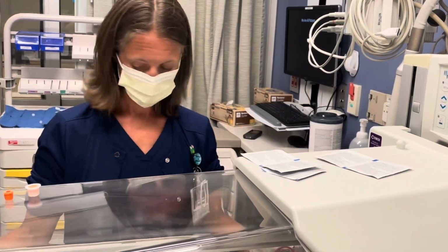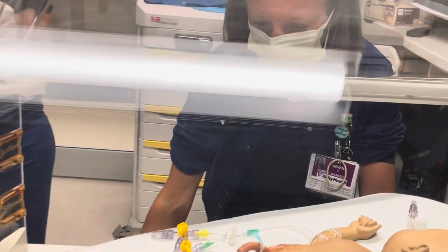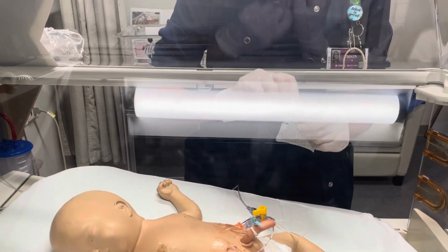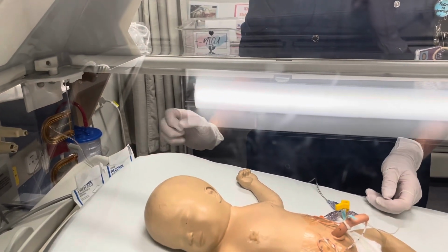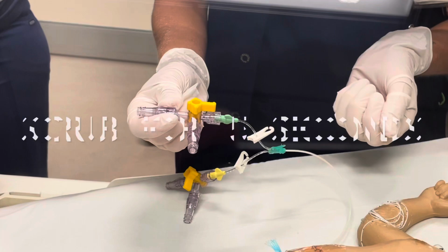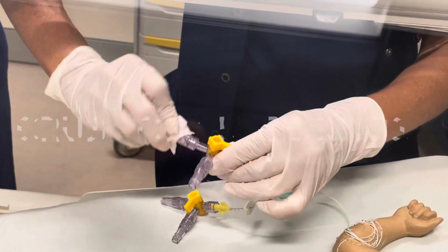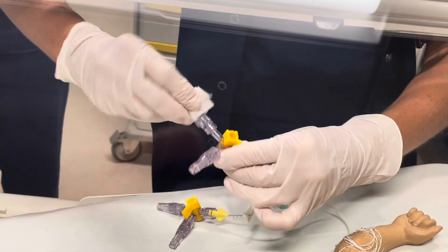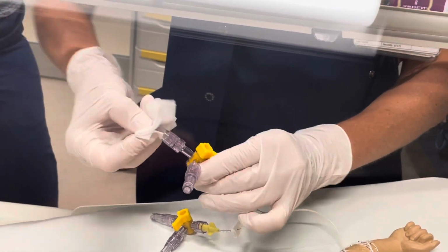Serena will turn on the air curtain feature on the giraffe to keep the heat inside of the bed. She has collected her clean alcohol pads and will place them at the head of the bed. This is deemed a clean area in your giraffe. Before accessing the microclave, she will scrub the port for 15 seconds. Emily, the first nurse, will attach the clean IV tubing.